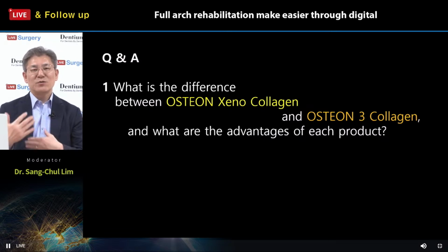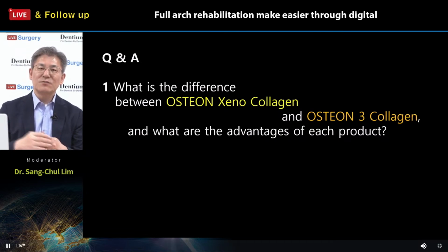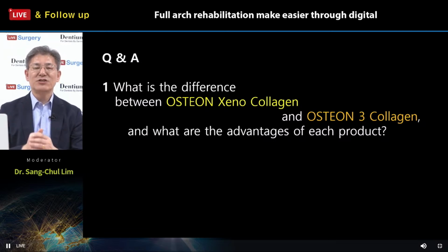So sometimes we can skip some of the fixation protocol, like suturing or pin fixation, when we choose this collagenated material, right? So that is my answer.